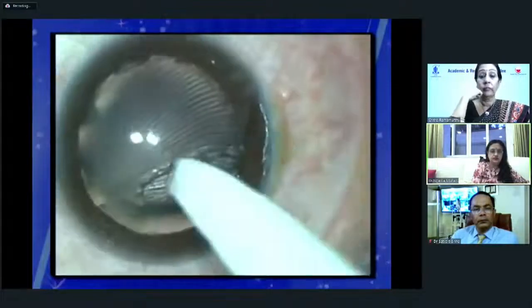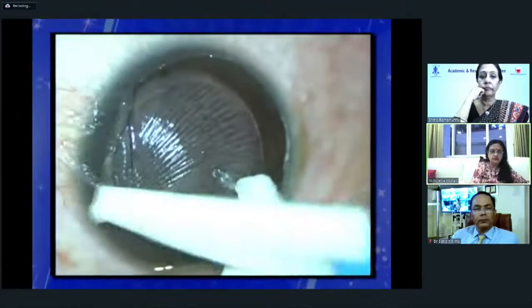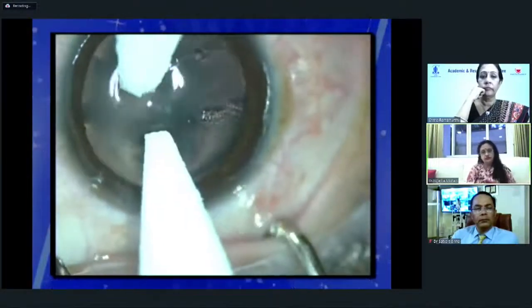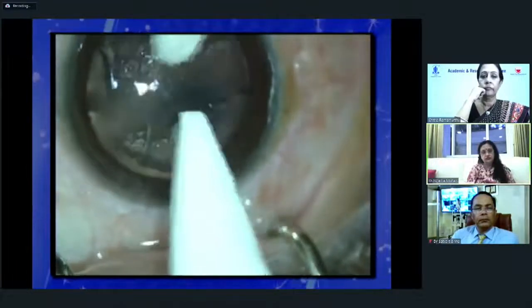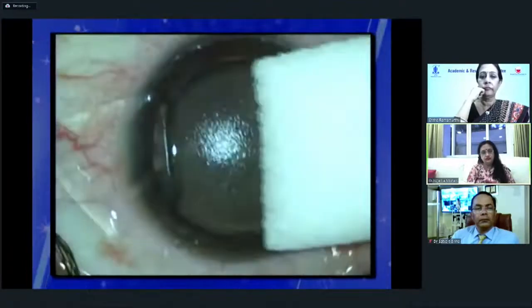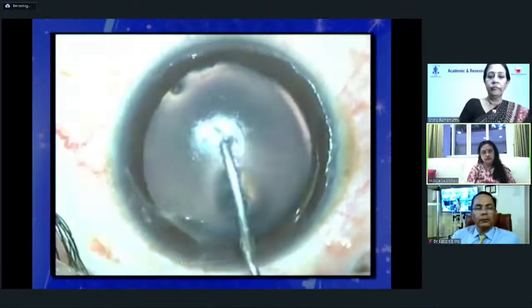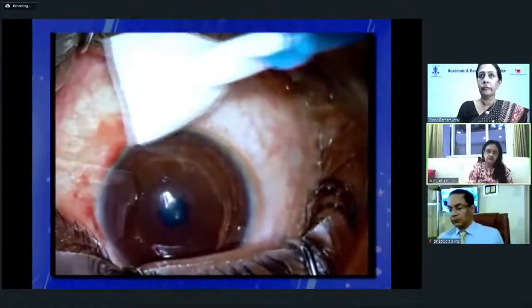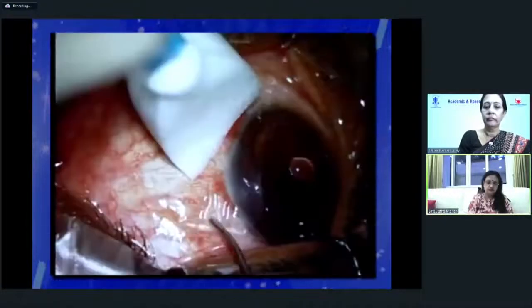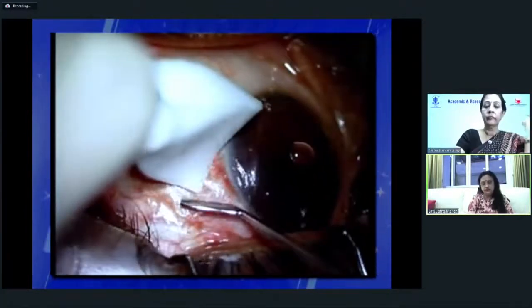The epithelium on the surface is also removed to facilitate the removal of striae. Stretching the striae is done using 2 dry Merocel sponges perpendicular to the direction of the striae. Flap is replaced after completely washing the interface. Fourth case shows a completely displaced flap with rolled edges. This video shows the importance of removing epithelium under the surface of the flap in addition to the stromal bed.